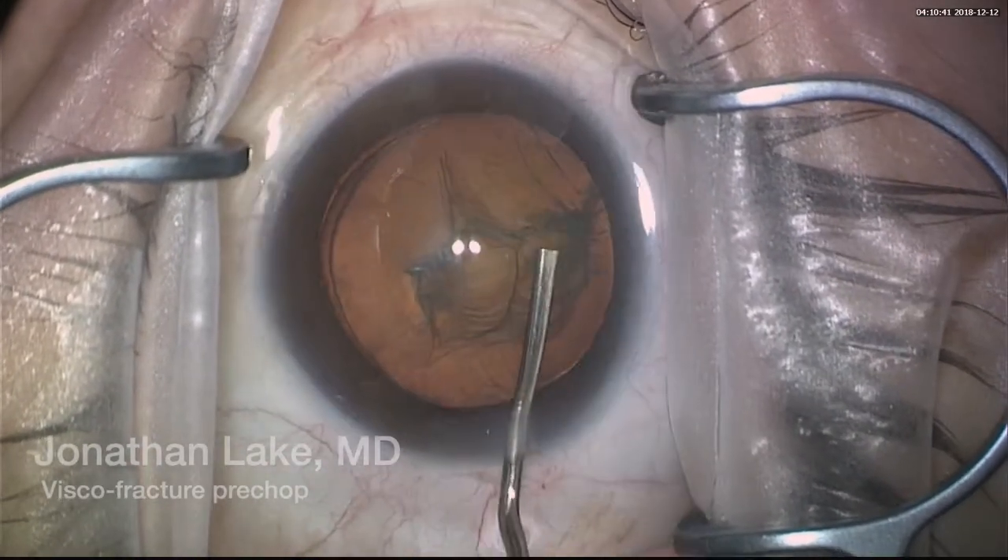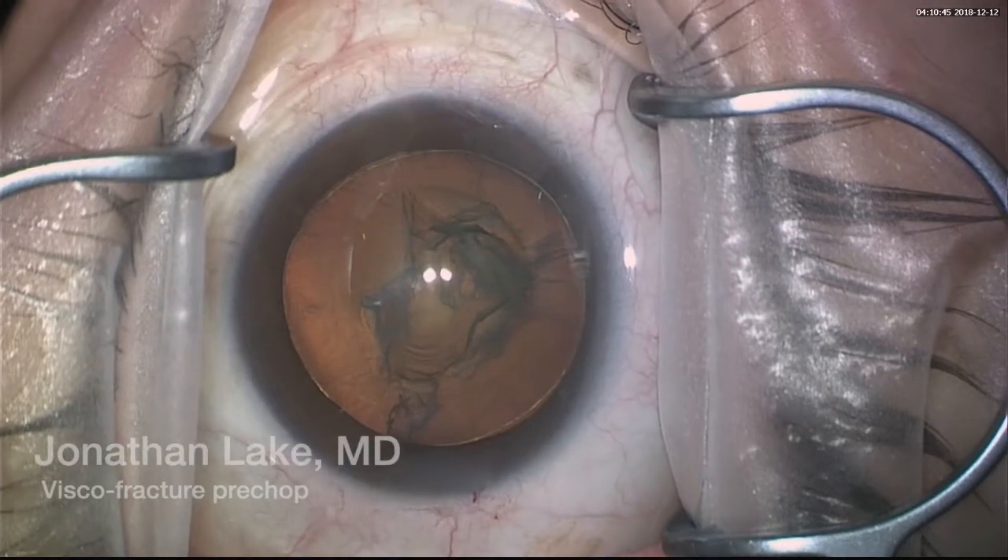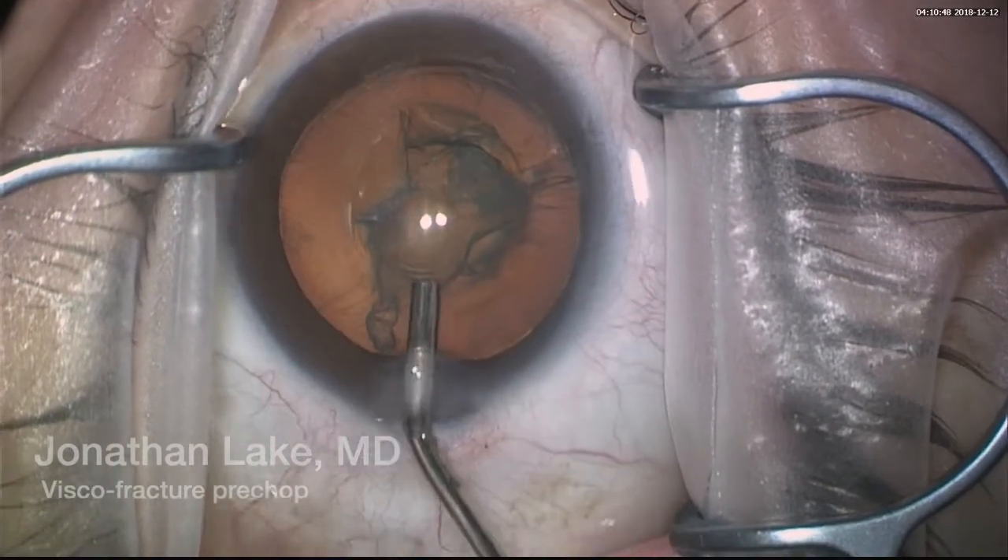We see that the wave passed without any problems. I also did hydrodelineation. Now here we go — Gustavo describes the center of the lens having sort of an opening, and we use that for the entrance of the viscoelastic.